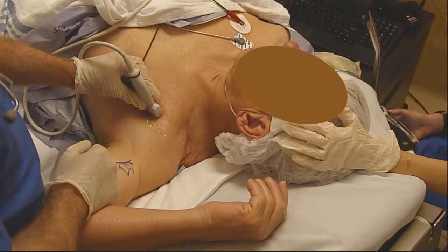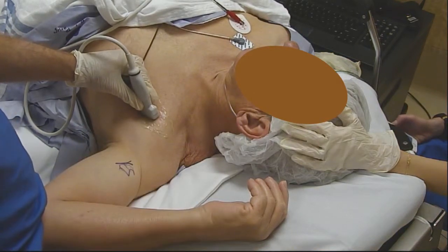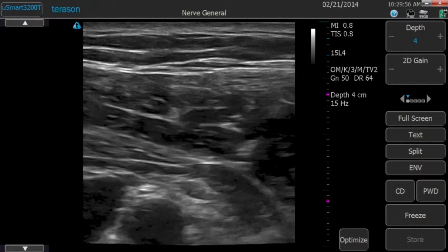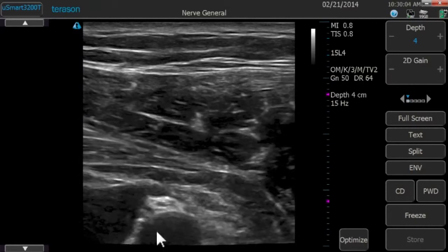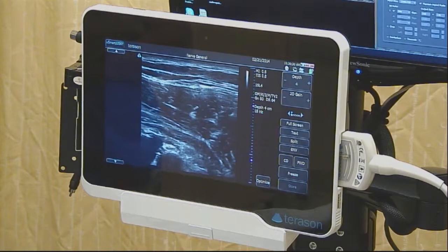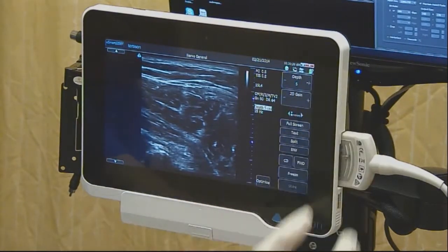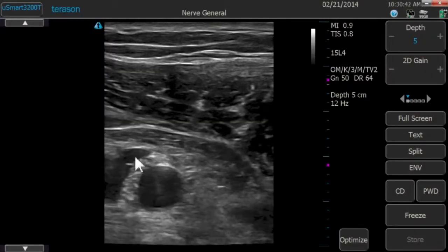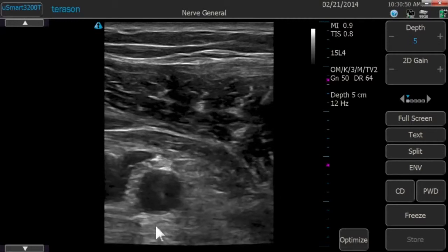Starting now with the rear-image view, we're going to show you the ultrasound screen with that initial position at around the deltopectoral groove. The first thing you're looking for is that axillary artery. This patient has a generally thicker chest wall, so the deep border of that axillary artery — dead center of the screen — is not visualized. We're currently at four centimeters depth, so we need to go deeper. By simply touching the right side of the depth marker on the tablet touchscreen, we can increase the depth to five centimeters, and now we have a much clearer view of the entire artery including its deep border and the posterior cord just deep to it.